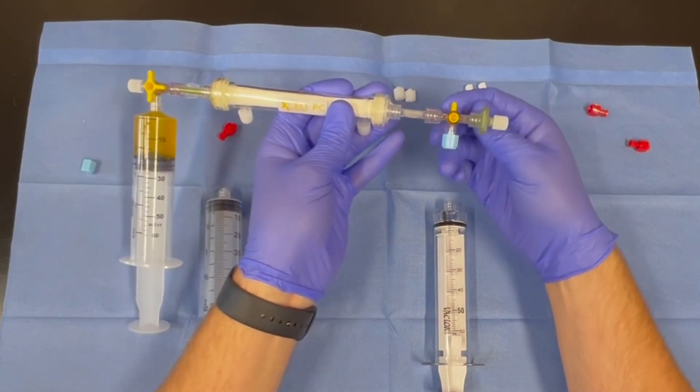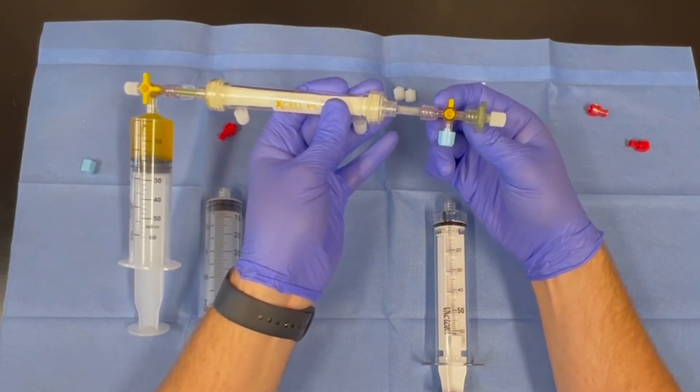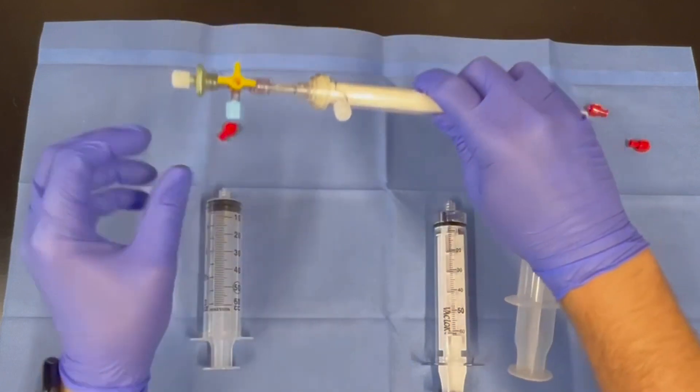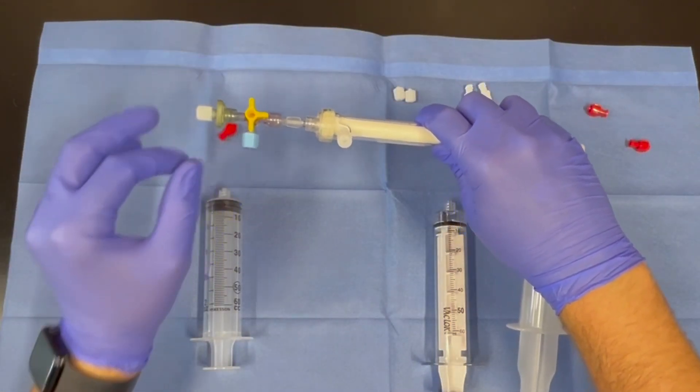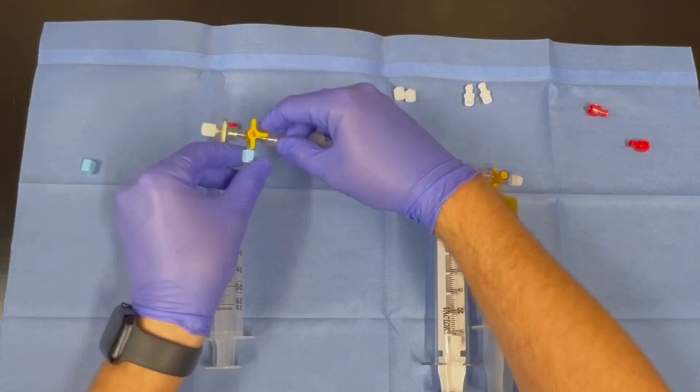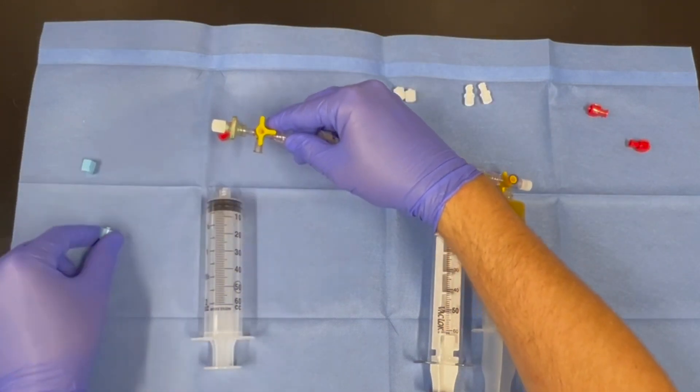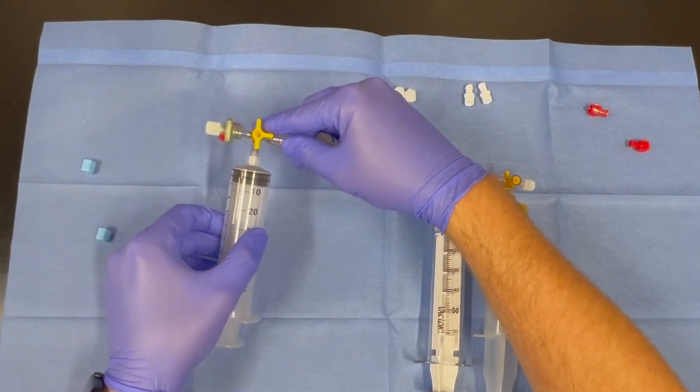Turn the entire filter over and orient the three-way stopcock as shown. Remove the second blue cap and connect the primed empty 60 ml syringe.